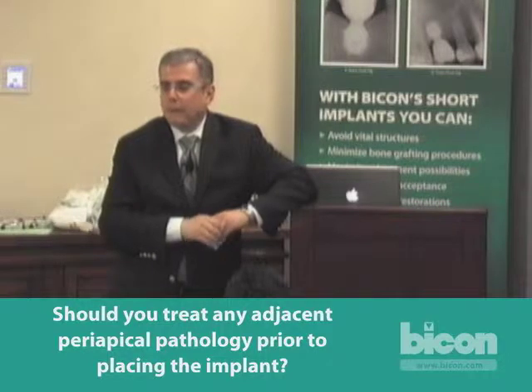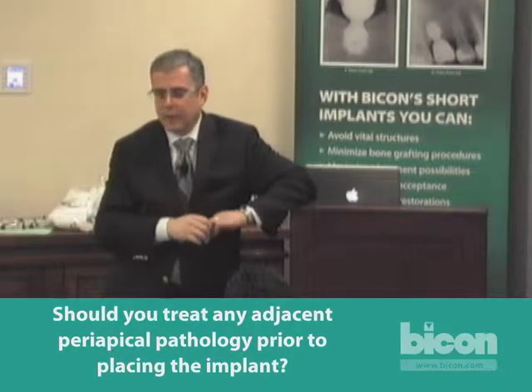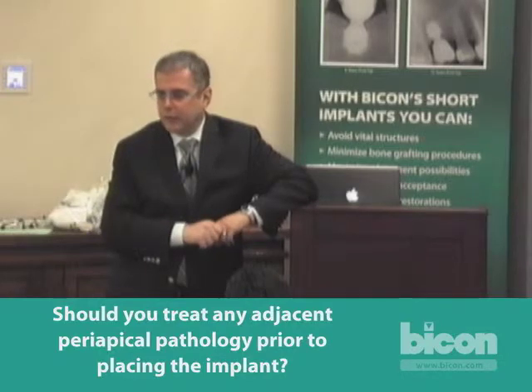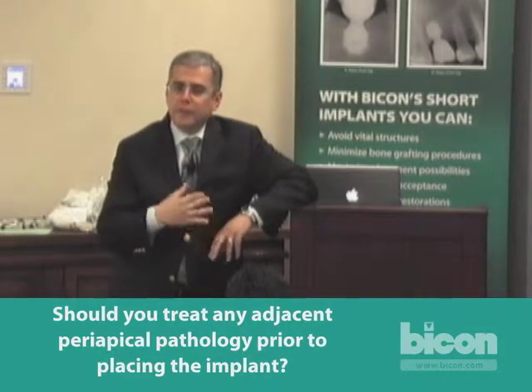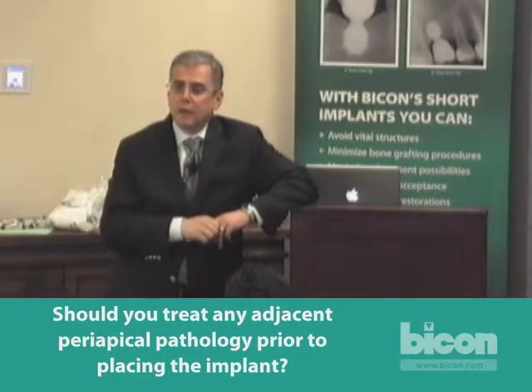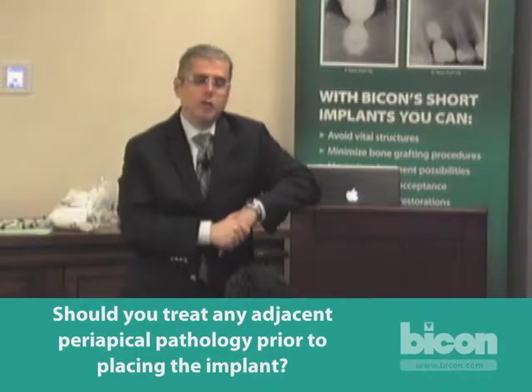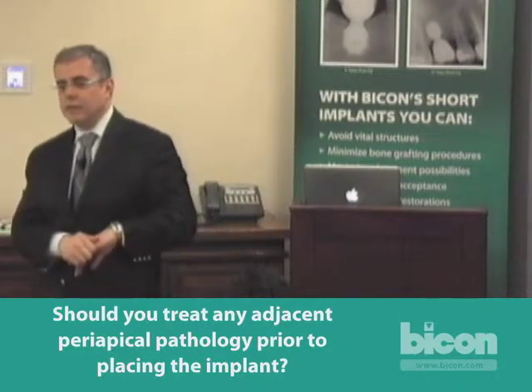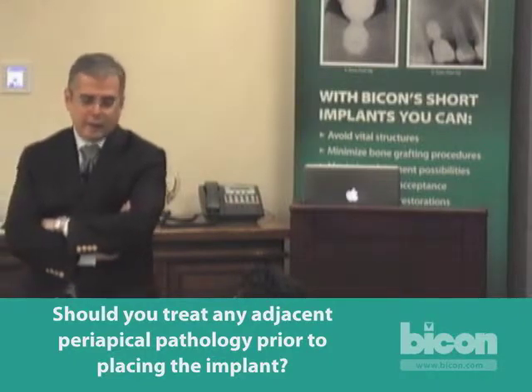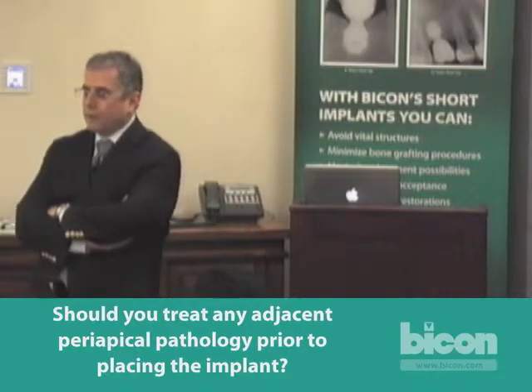Absolutely. One of the mainstays or real important principles of treating any implant, for that matter, is before you start the surgery on the particular day to take a periapical. If there is any pathology of the adjacent teeth, especially periapical pathology, that should be treated. Because when you go in and you stir the whole thing, you mix it up, you may drill right into that periapical lesion. You not only are risking infecting the implant site, you're risking making it all blow up with pain and an acute pulpitis of the tooth and a failure of the implant.